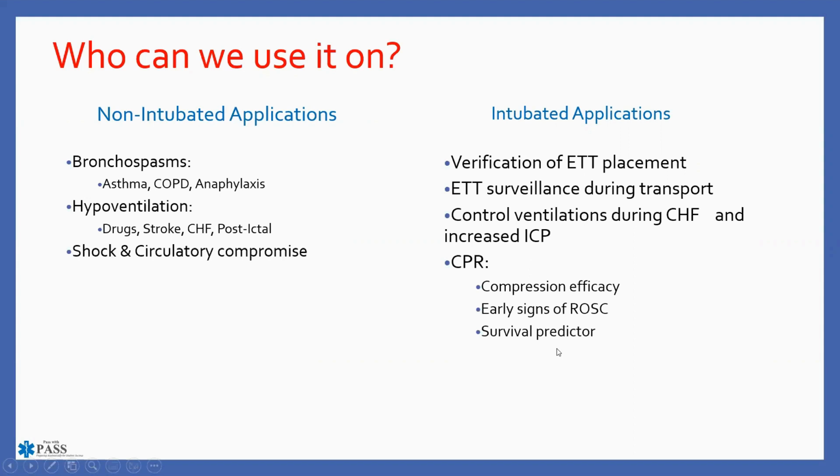And then survival predictor, why I have this in here, there was some information I thought would come out in the 2020 guidelines that did not. We'll probably be getting a new set of guidelines in 2025. American Heart is generally on a 5-year gap. But what they were looking at is that if EMS got to the patient, intubated them, and we had an initial end-tidal CO2 of less than 10, then we knew it was basically going to be a futile attempt as far as the resuscitation. So there was some information that they were kicking around about not even starting CPR in these situations if their initial end-tidal CO2 was less than 10.